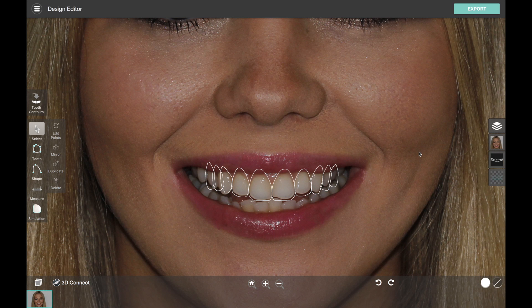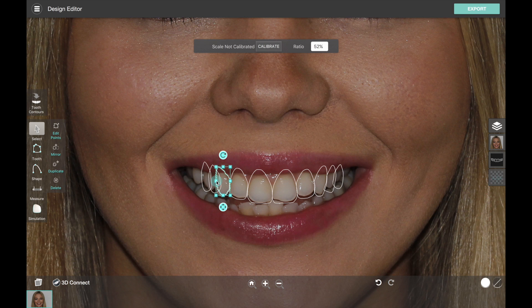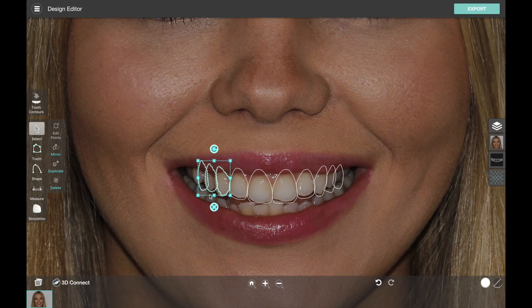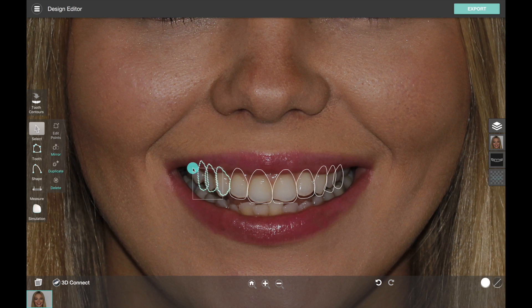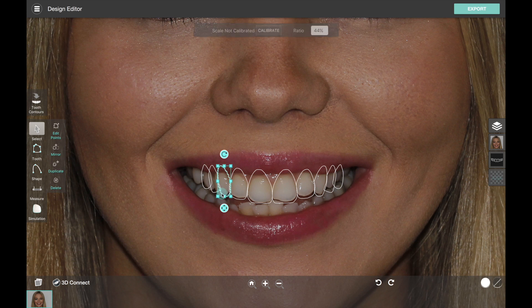I want to hide the guide and work with the teeth. It gave me a pretty good proposal for this case but maybe I want to customize it a little — I'll make the canine a bit wider, grab these teeth and adjust them, move them maybe a little higher. Smile Designer's editing tools make it really easy to define your contours. If you want to mirror teeth across the midline and create a symmetric look, you can easily do that. Over here on the left side we have a mirror function, and if I tap that it creates a copy of the teeth and mirrors them across the midline — really handy for creating a more symmetric smile.